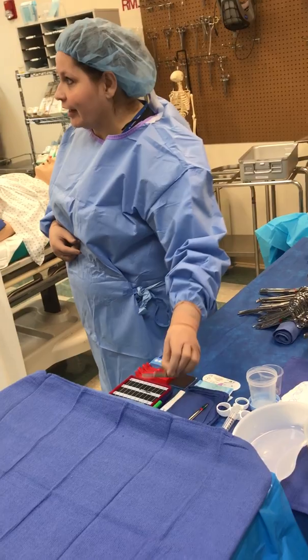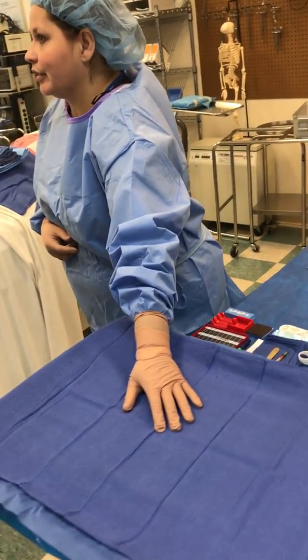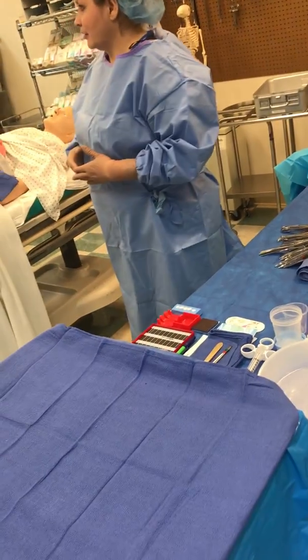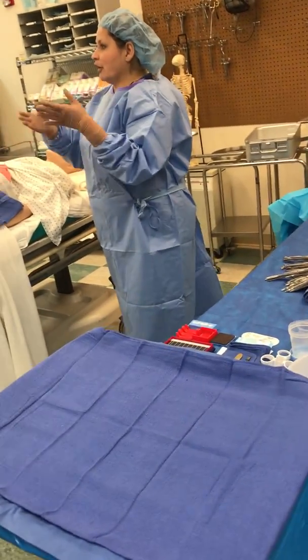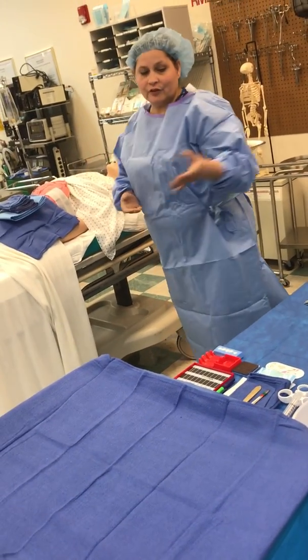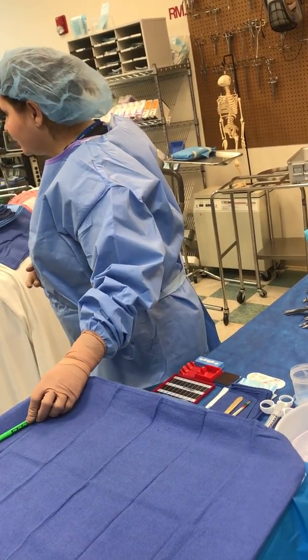Then I load my knife handles. My next thing to do is to get my mayo ready, because that's what I'm gonna be doing. So when everything's said and done, what is the first thing I'm gonna be doing? We're gonna be gowning and gloving the surgeon, draping the patient. The first thing he's gonna ask for is a marking pen, right?